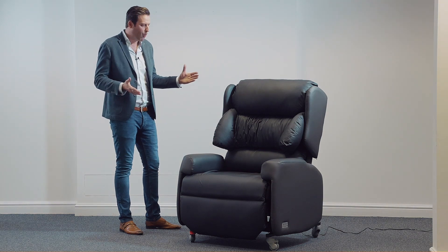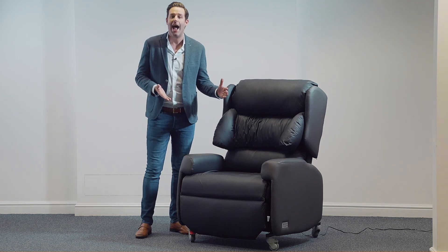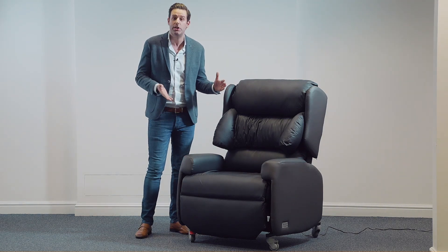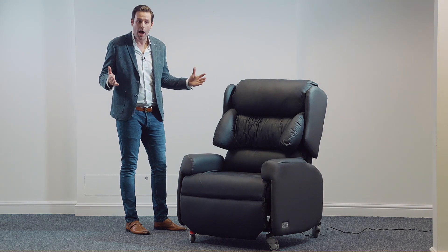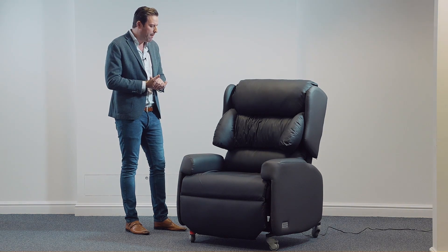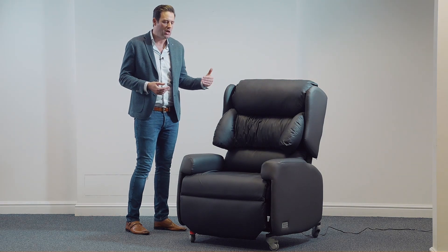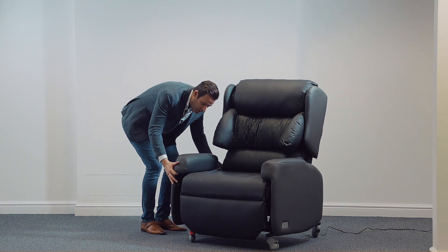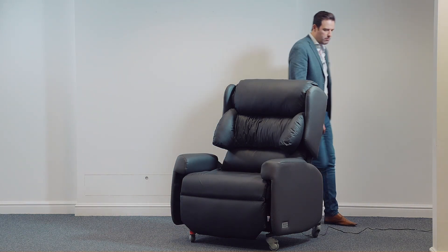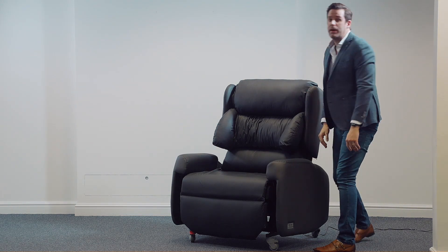First and foremost, let's look at seat width. At the moment on this chair, this is actually the chair at its narrowest setting, which is 28 inches across. If we need to widen that chair for a patient, we can simply twist open a knob on either side at the rear of the chair, which allows us to pull out and then tighten at a width to suit.